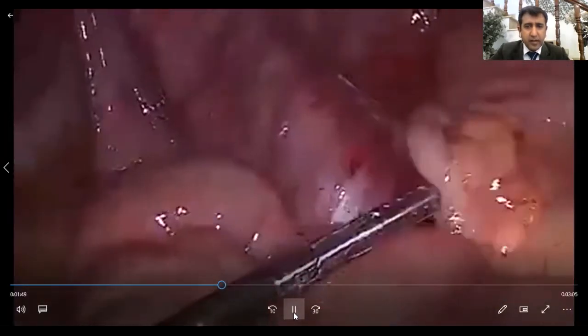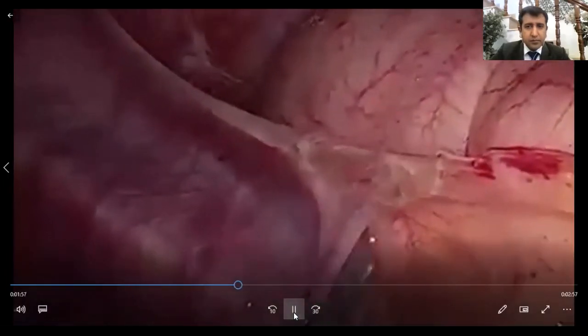Inspection of the proximal 2-3 feet for any Meckel's diverticulum, lesions, or any structures, any other incidental inflammatory findings. If you are a good expert in using the monopolar hook, the hook is a very good instrument for dissection in many places.